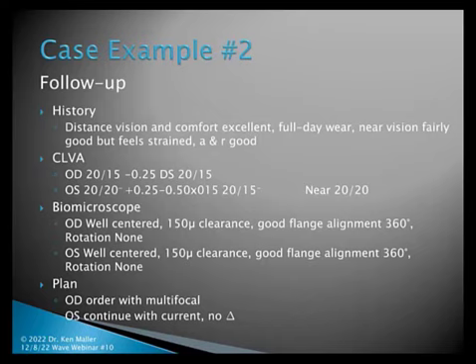So here's a case that had failed with the first doctor through I don't know how many lenses over 9 months. On the second doctor through 7 months of whatever lenses they went through. And in this case, the lenses were pretty much fit on the first pair and done. Little fine tuning on the script, and that was it.